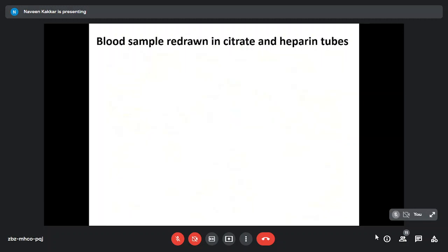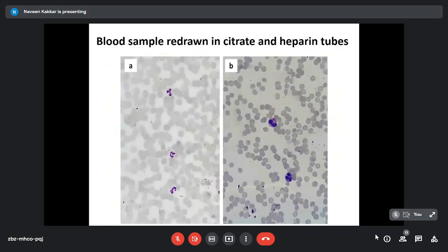So the blood sample was redrawn in citrate and heparin. That's what we got again. Now, no points for guessing which one is heparin. The one on the left is fuzzed. This one is more sharp, the citrate one.